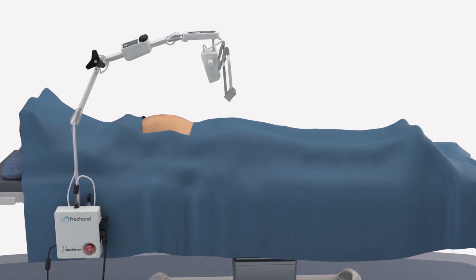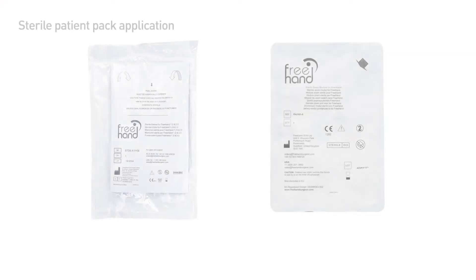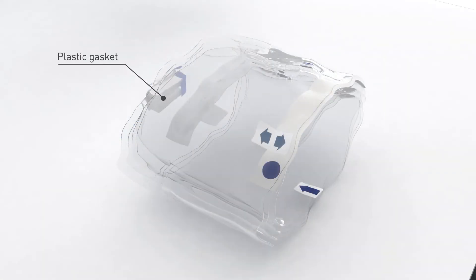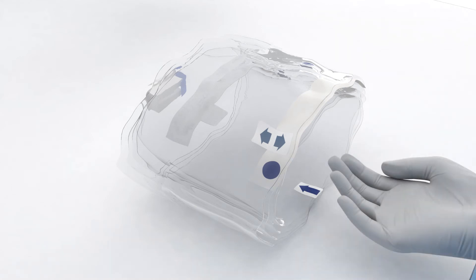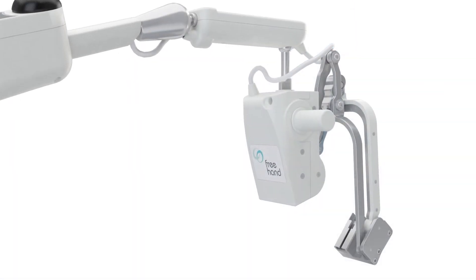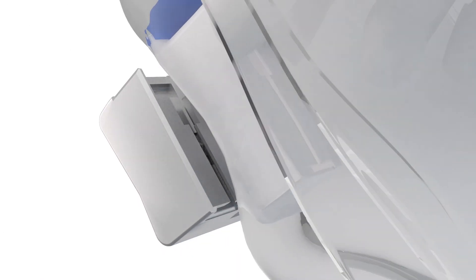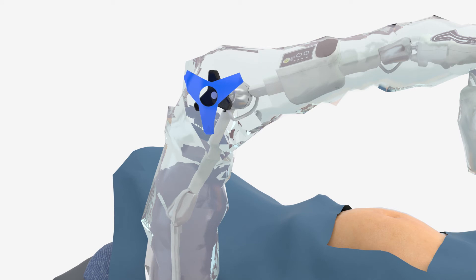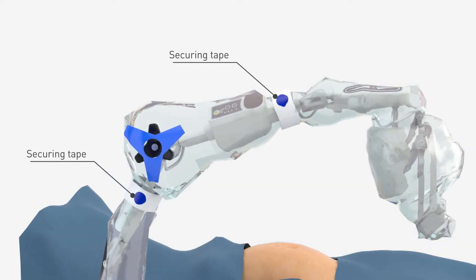The patient is prepared for surgery and then draped. The sterile patient pack is made up of two parts: the sterile sleeve and the zoom module. Fitting the sterile sleeve is undertaken first. Unpack the sleeve and grasp the plastic gasket by placing a hand into the sleeve at the level marked by the blue arrow. Ease the gasket over the foot of the tilt assembly, ensuring the pattern of the foot and gasket match and the blue tab is at the top. Pull the sleeve gently over the arm all the way down to the control box, taking care to preserve the outer sleeve's surface sterility. Ensure that the blue knob marker is aligned with the black arm knob, then use the securing tapes to loosely tidy up the sleeve while allowing for unrestricted robotic movement.